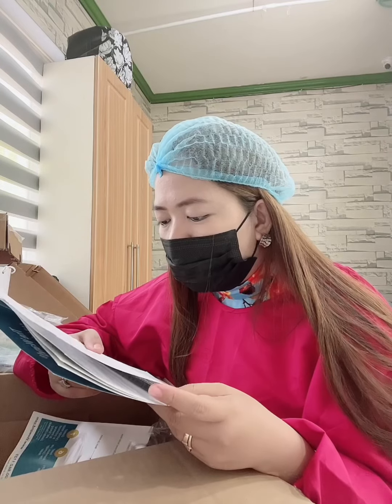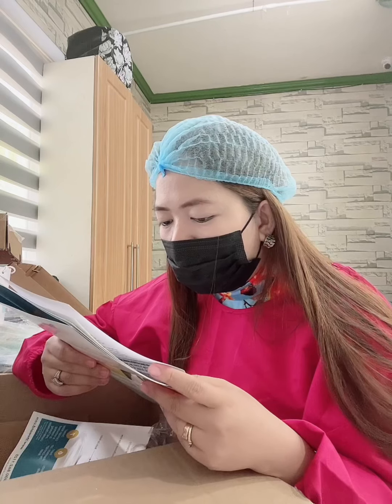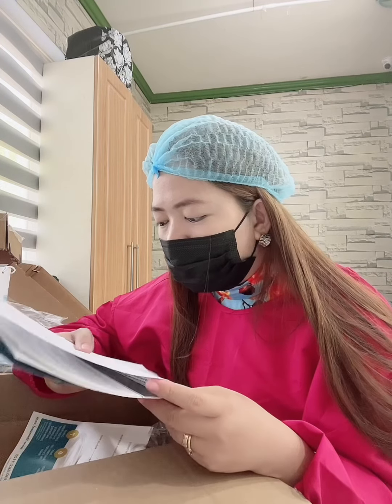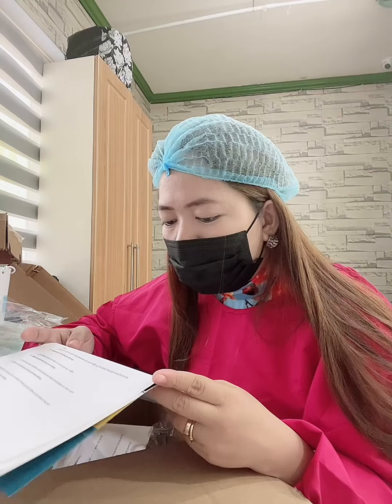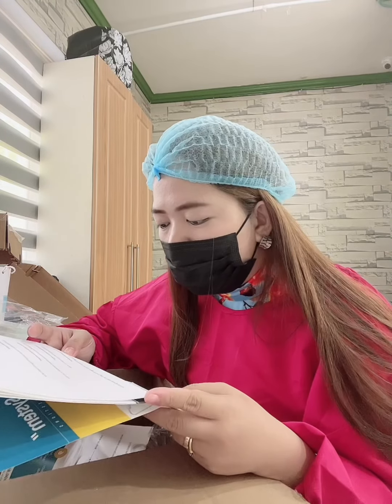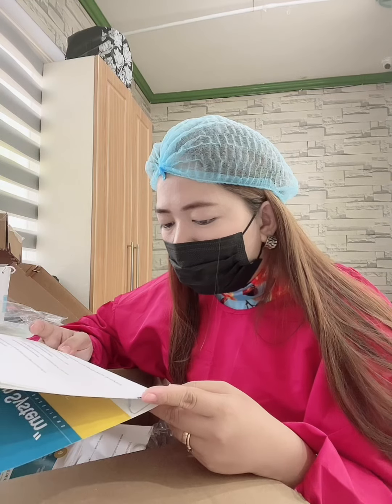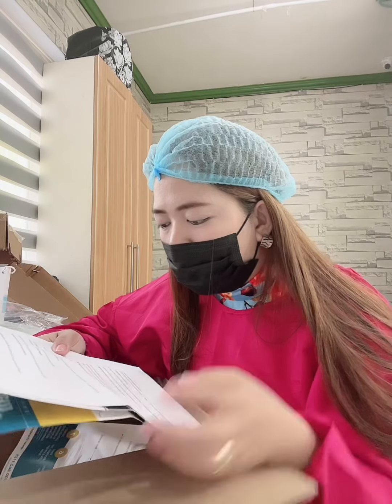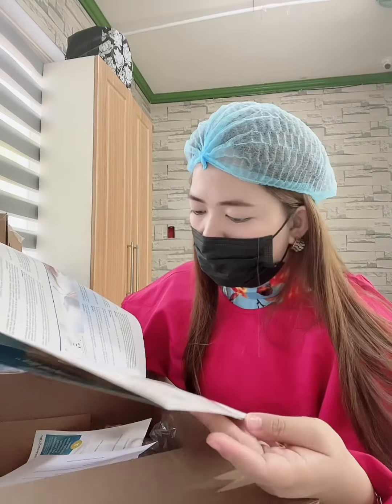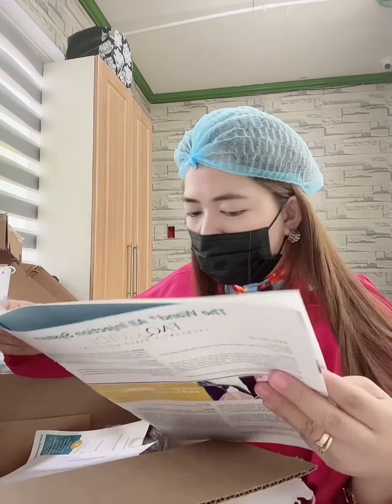Why do you enter the sulcus? Enter the sulcus of the tooth between the line angle of the tooth and the interproximal space. Do you push down into the periodontal space and penetrate the periodontal ligament? This injection requires light pressure. Place the needle into the sulcus the same way you use a periodontal probe, with minimum hand pressure. Eliminating the worry about a child biting their lip is the best part.